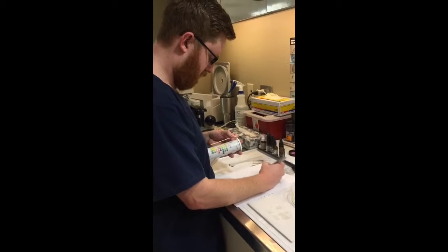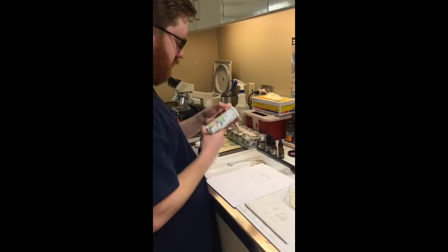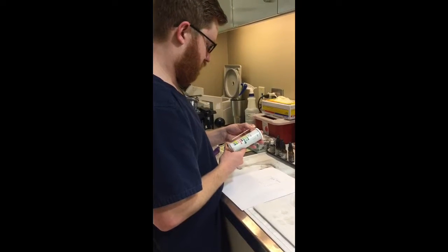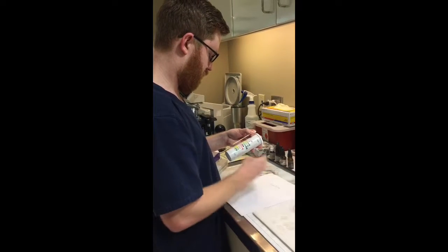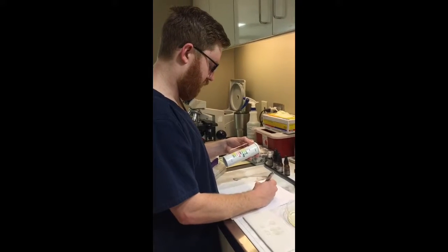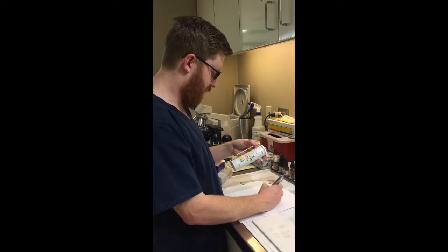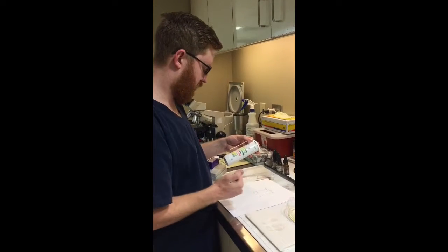Leukocytes, it looks to be negative. Nitrites is negative as well. The pH is about 7.5. Protein is negative. Okay. And then the glucose, ketones, and uro are both negative. The urobilinogen is normal. The bilirubin is negative, and it's negative for blood as well.